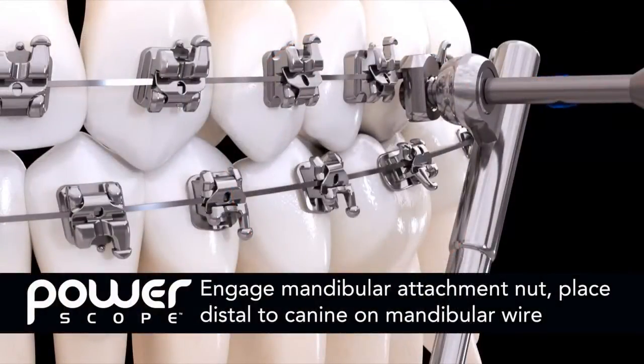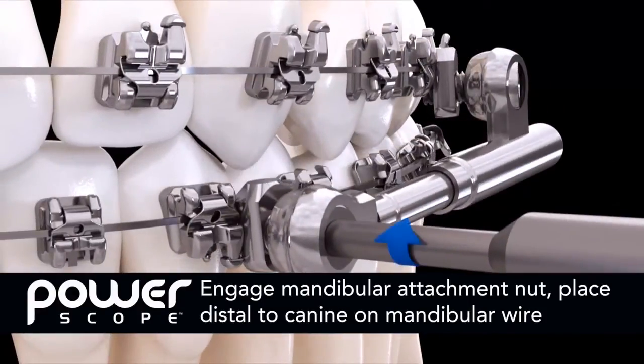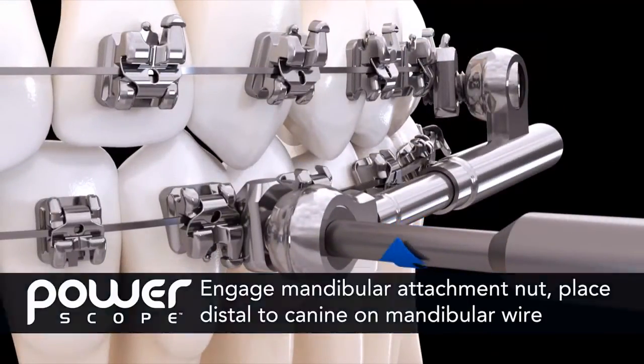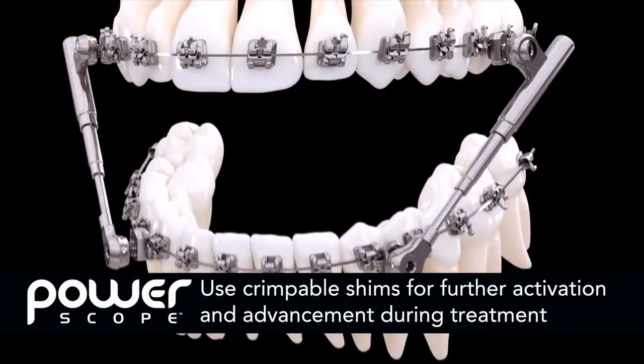After tightening the maxillary attachment, engage the mandibular attachment nuts using the wrench. Place it distal to the canine on the mandibular wire and tighten the screw. Crimpable shims can be used to get further activation and advancement during treatment.